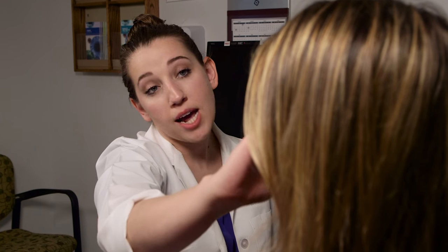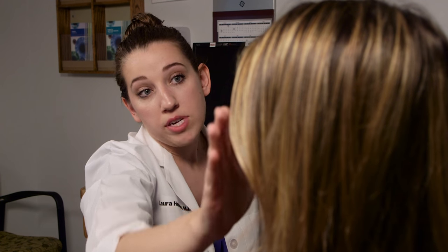You cover, uncover — then you do the other side: cover, uncover. Her eyes are very well aligned. For the next part of the test, we do the cross-cover test, which looks for a phoria — that's a latent deviation, or one that's only present when you break binocular fusion. You cover the right eye and then directly switch to the left eye and then back to the right, breaking the binocular fusion. Again, you watch for any refixation movements of each eye.